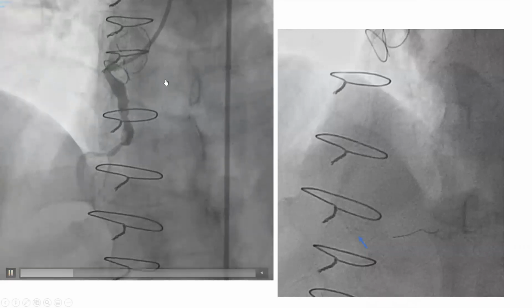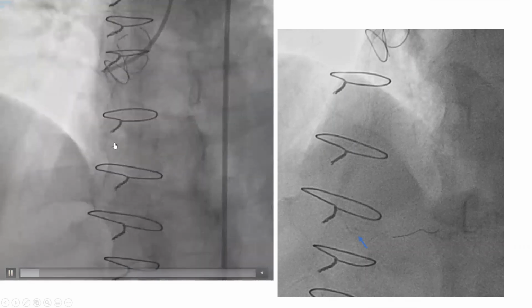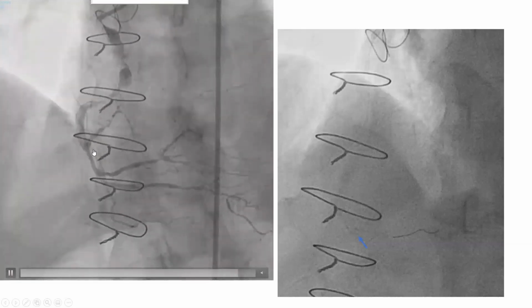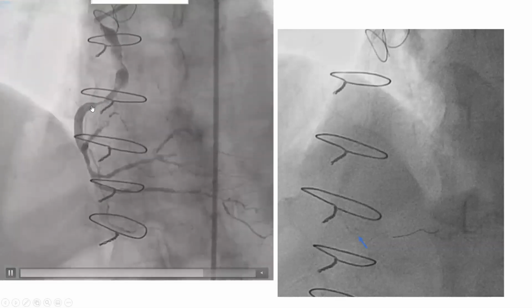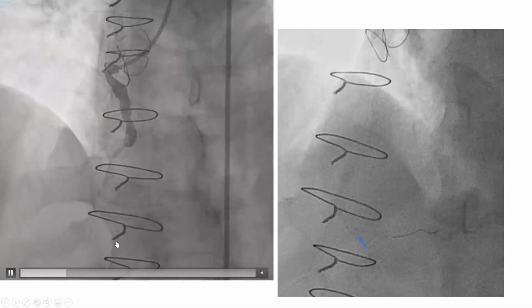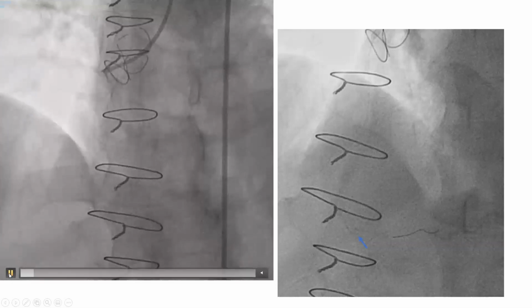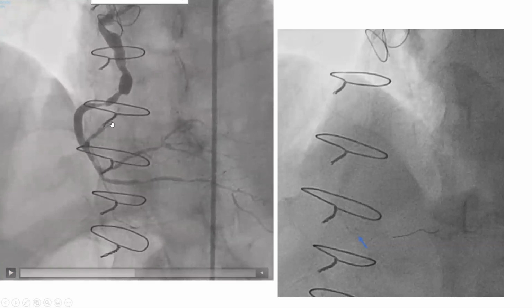This is an example of a heavily redundant atheromatous vein graft to RCA that is 20 years old. The lesion, the tightest spot is here, and the lesion is very close to the anastomosis. You want, like I said, 4 or 5 centimeters to be safe. Here there is about maybe 2.5 centimeters. Since there isn't much filling retrogradely into the native vessel, this is the anastomosis here, but there isn't much retrograde vessel. So it's okay to deploy a basket in the native vessel before that major anastomosis. So it's okay to deploy it here.